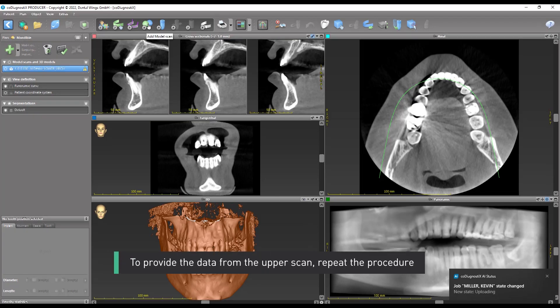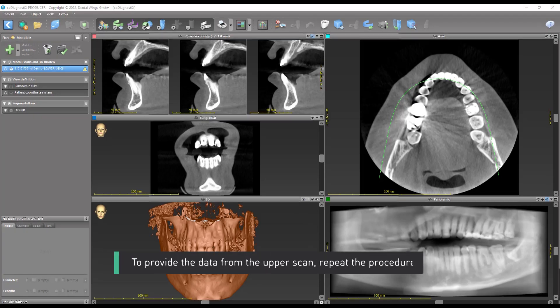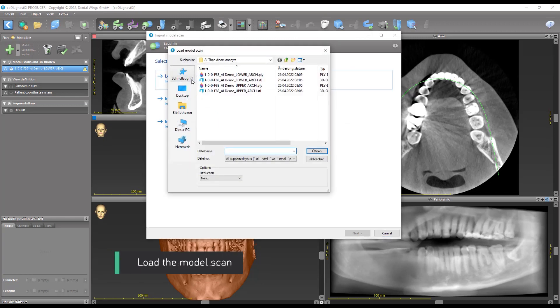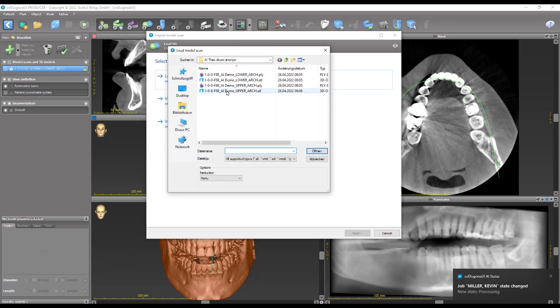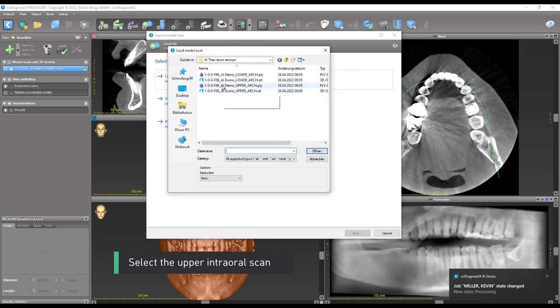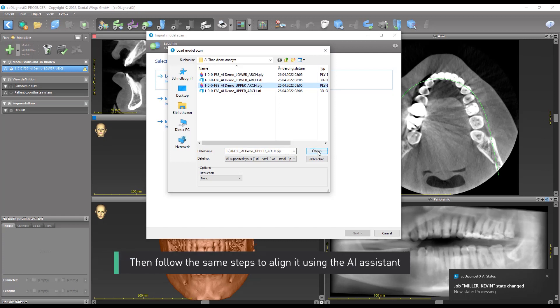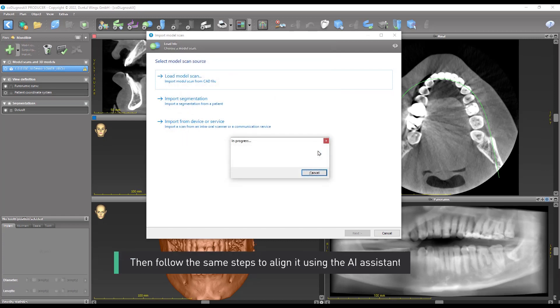To provide the data from the upper scan, repeat the procedure. Load the model scan. Select the upper intraoral scan. Then follow the same steps to align it using the AI assistant.